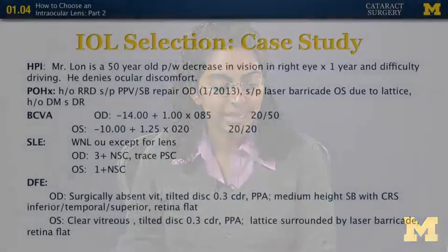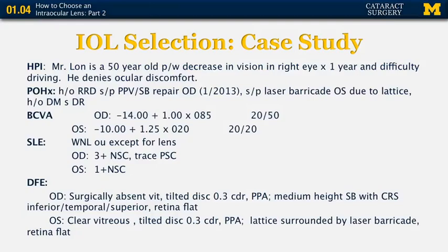Before moving on to the actual calc sheet, we want to just take in the patient scenario and see if all of it really makes sense to us. We should already be thinking about why things are what they are. So, for example, if we take the manifest refraction, we right off see that the right eye is about 4 diopters more myopic than the left eye, -14 versus -10. We'd want to be thinking, why is that? Is there an underlying cause or reason for that? Is it maybe the scleral buckle that explains why that right eye is more myopic?